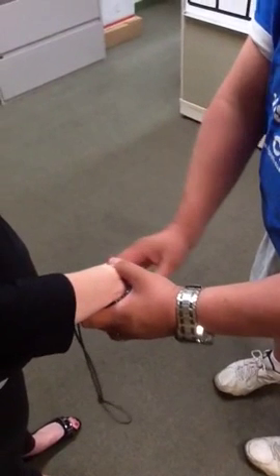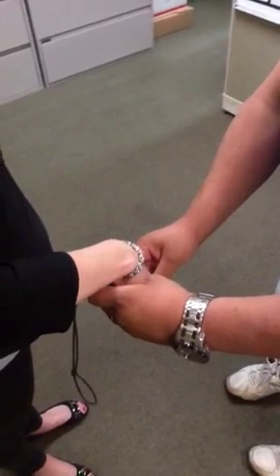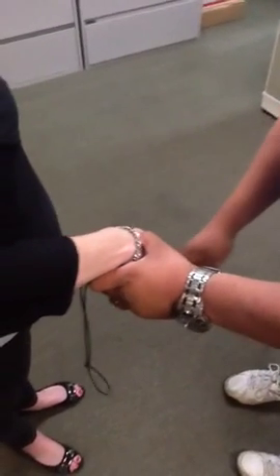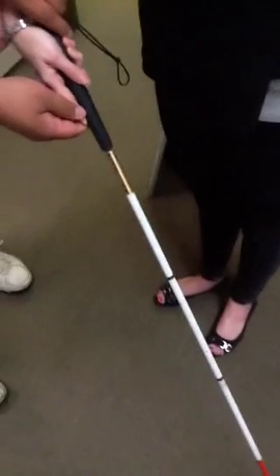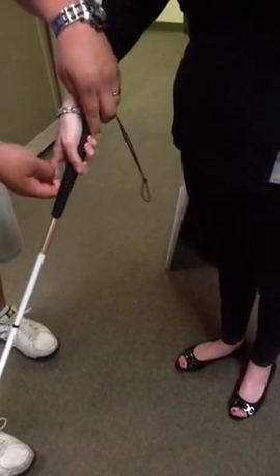Now, if you grab the cane and stick your finger on the flat part of the cane and kind of bend it, so the way you're bending it, if you move your finger straight, let's turn it this way with your wrist. Okay. Relax your wrist. So when you bend your finger like so, and you straighten it out, it'll push your cane this way. Then when you relax your finger, it'll push your cane that way.